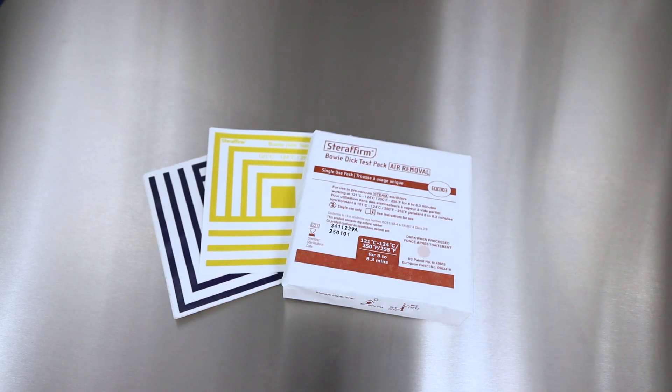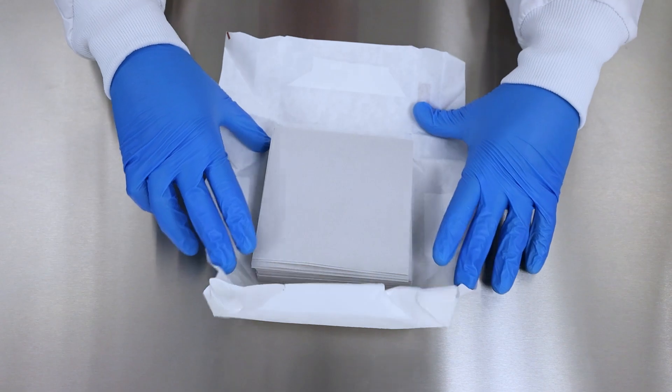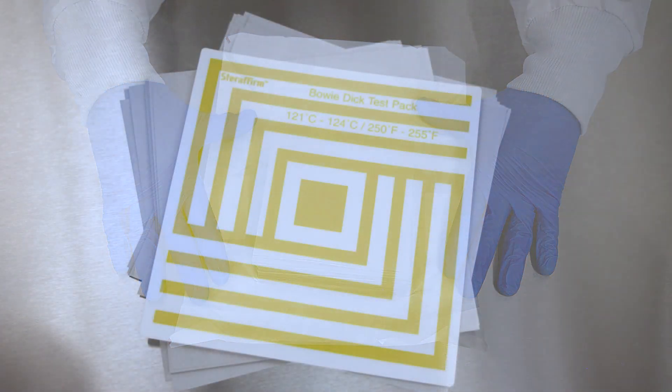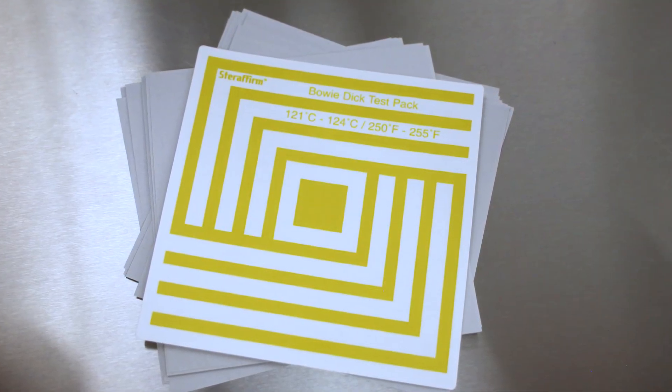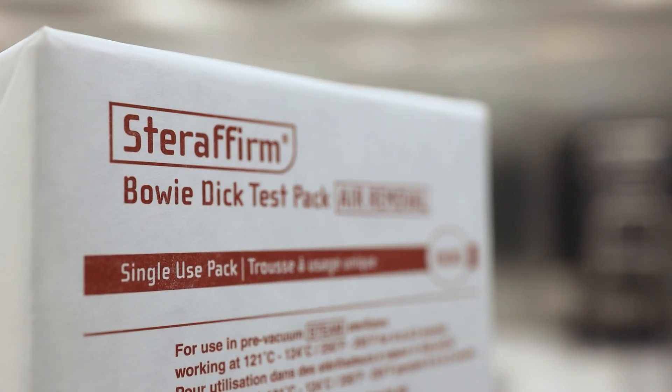A test pack consists of a set of air removal and steam penetration barriers. In the center of each pack is a chemical indicator sheet. Each test pack is preassembled and intended for a single use.